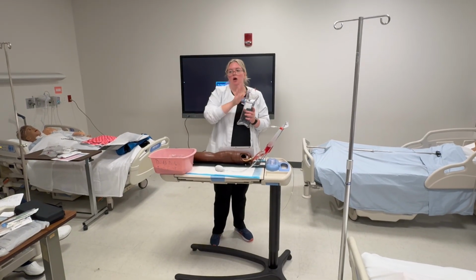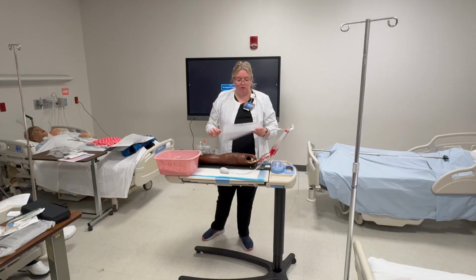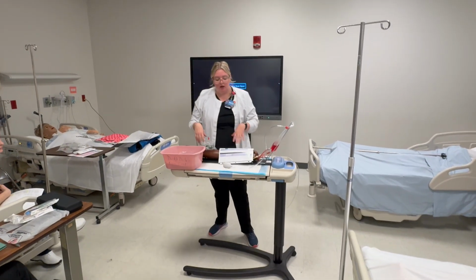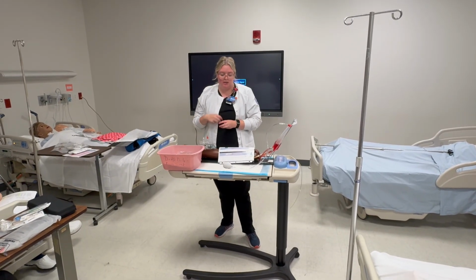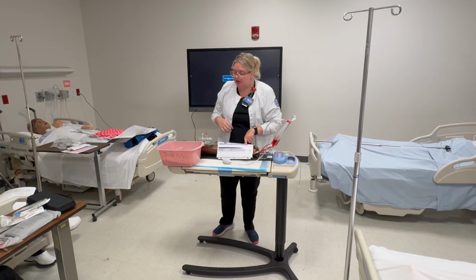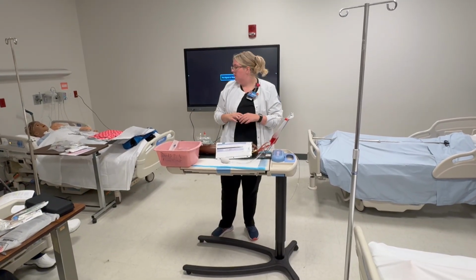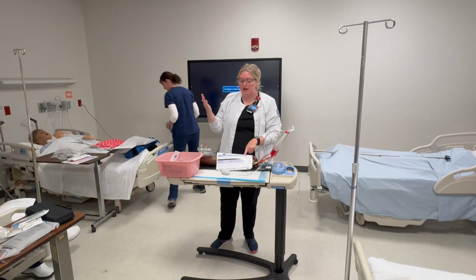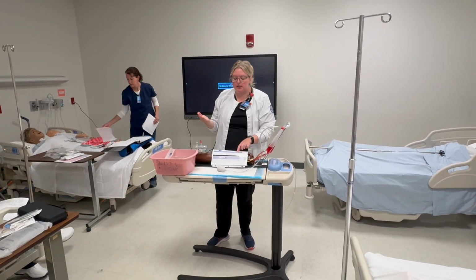So I'm going to do that all for normal saline, and then I'm going to do that again for whatever other medication I'm giving. I've got my right patient, John Smith. I've got my right medication, which is gentamicin. I'm looking at my bag. This is gentamicin. My right dose, 60 milligrams.